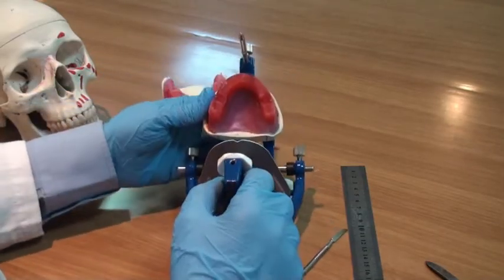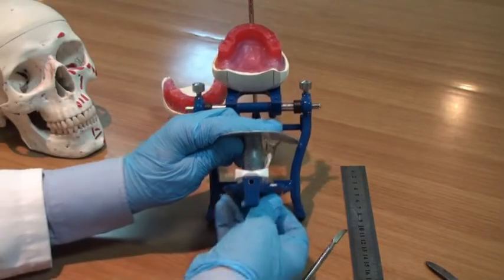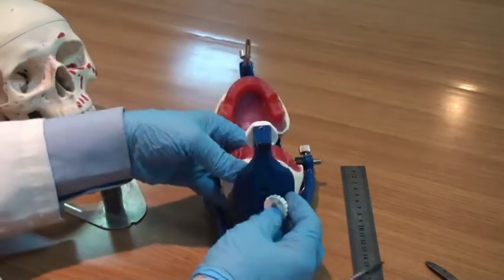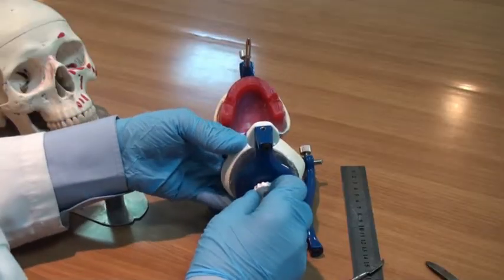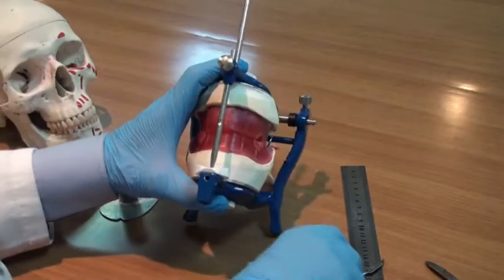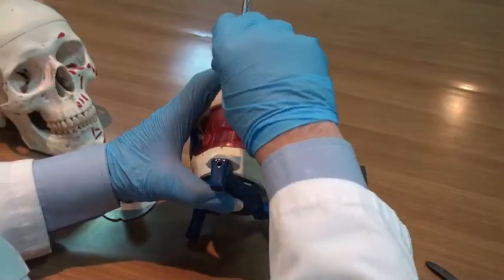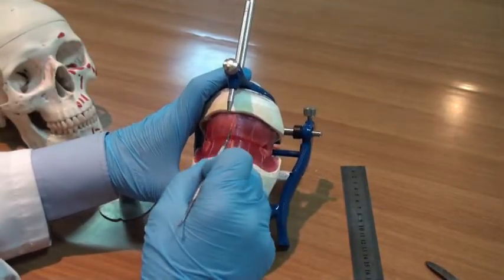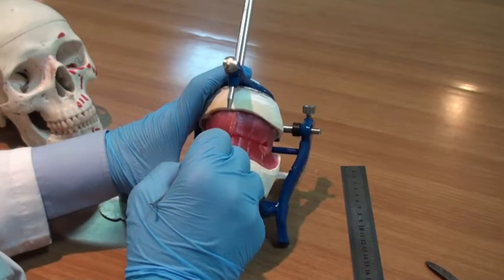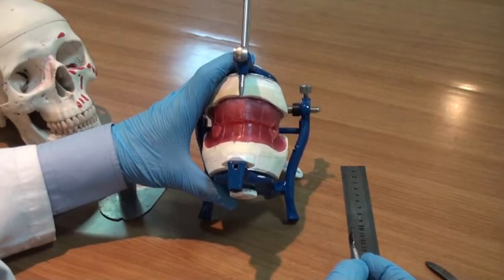Now, this midline must be transferred to the lower wax rim. We can replace the lower cast with the lower wax rim in its place securely. Now, if you close them, you can move the incisal pin a little bit so you have good access to the labial surface of the wax rims, and you extend the midline to the lower wax rim.